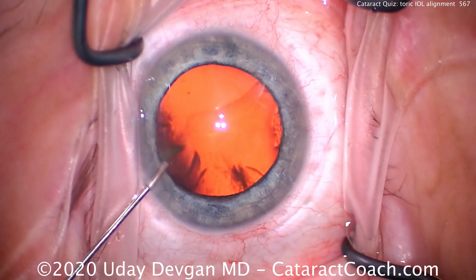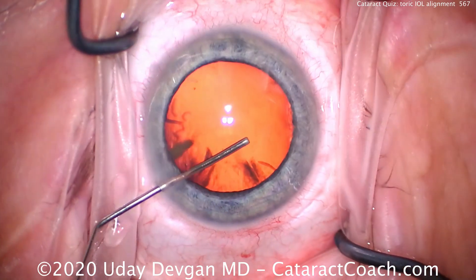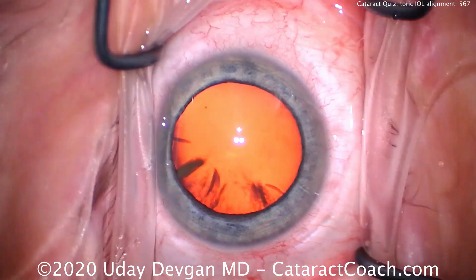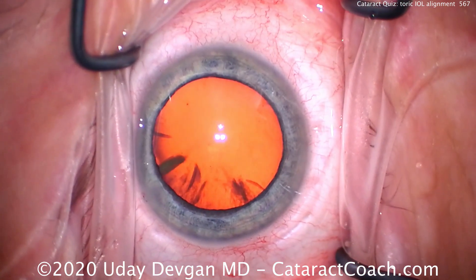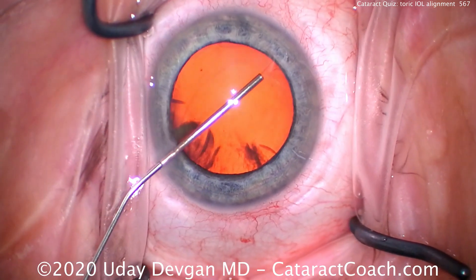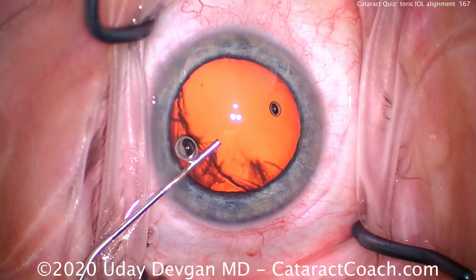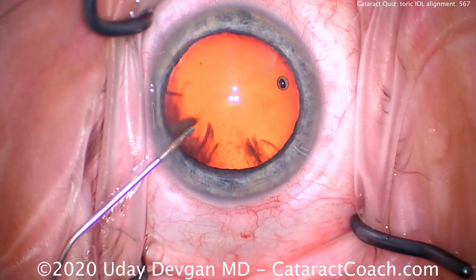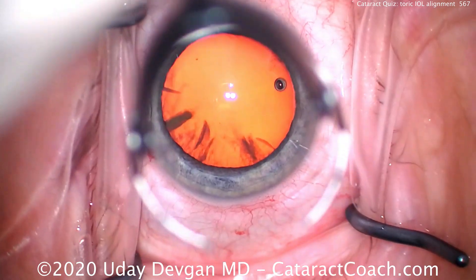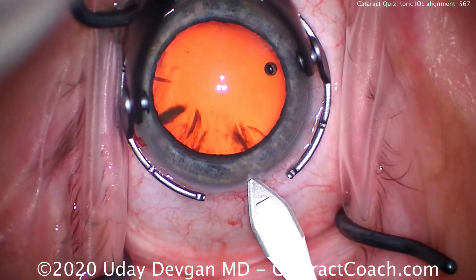Now we're going to fill the eye with our viscoelastic and anesthetic and go from there. We'll make our main incision as well. We know we want to make the main incision ideally on the steep axis, but if not, we can make it on the flat axis as well. The flat axis is appropriate, though it will slightly increase the total amount of astigmatism — it will not shift the meridian of astigmatism.